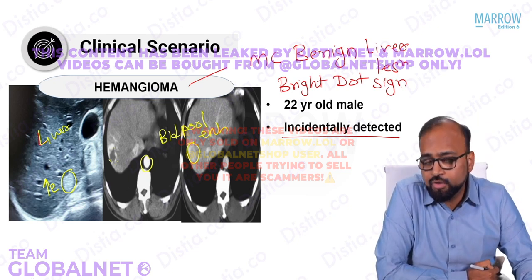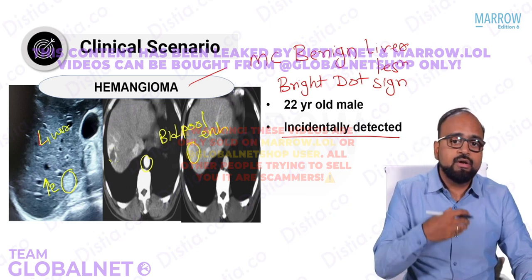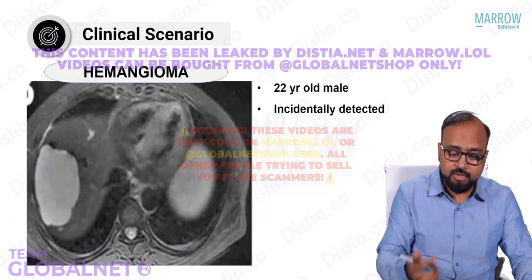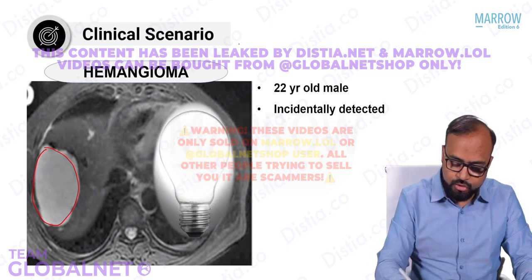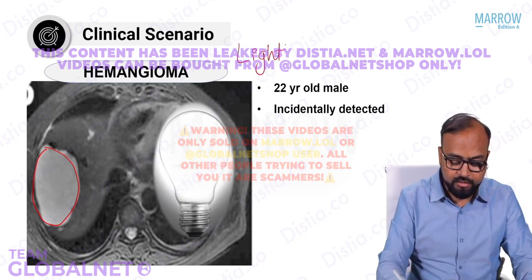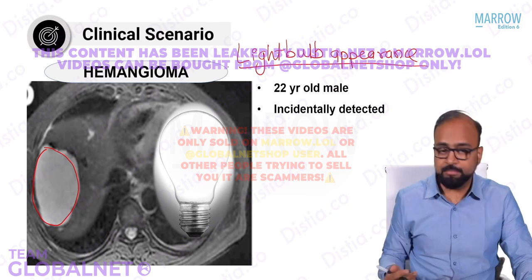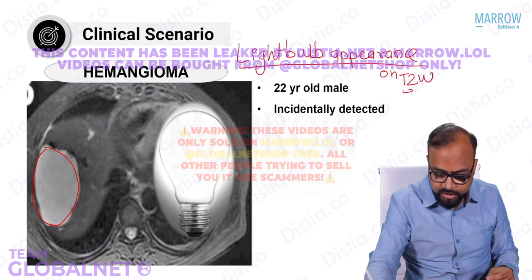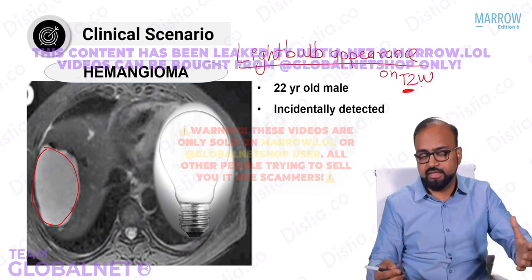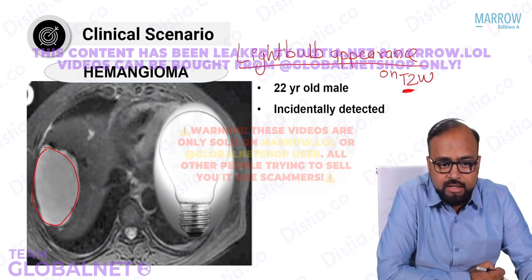Now on MRI, because it contains fluid or blood within the blood vessels, right? On MRI, on a T2 weighted image, a hemangioma appears extremely bright like this, and this is given a name. This is called as the light bulb appearance. Increasing the T2 weightage increases the brightness, right? So this is what is called as the light bulb appearance of hemangioma on T2 weighted MRI images.